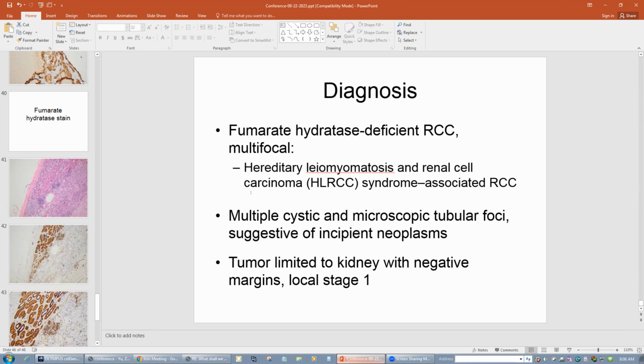Okay. So this case is unusual because they already know the mutation, and because the mutation is a germline mutation. Yeah, in adults, it is sometimes a germline mutation, sometimes a somatic mutation. I would think there was some family history here then? This one does not have a family history.